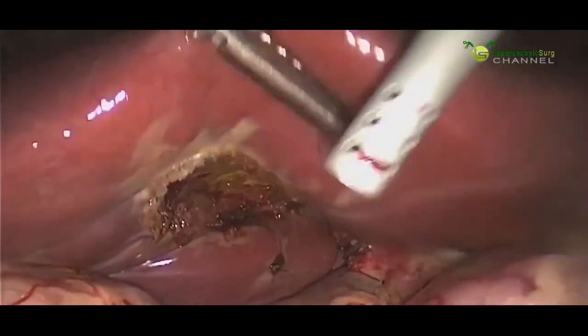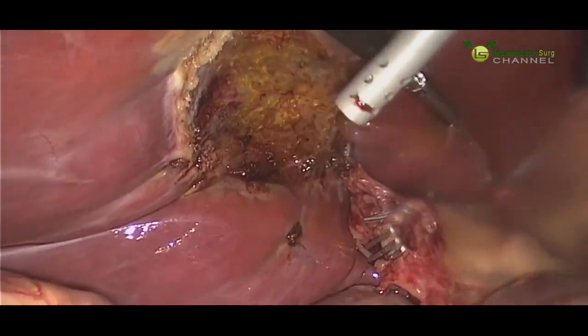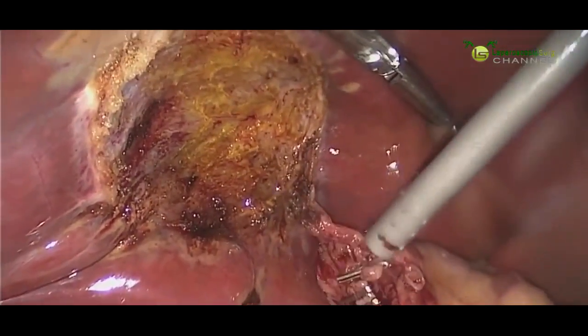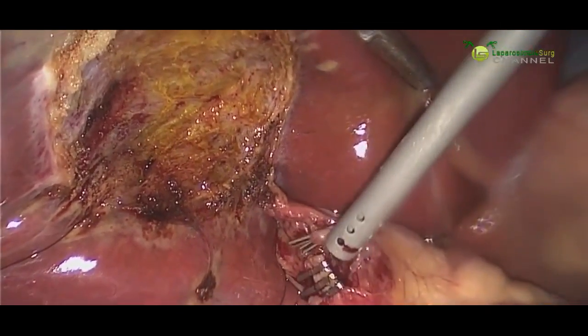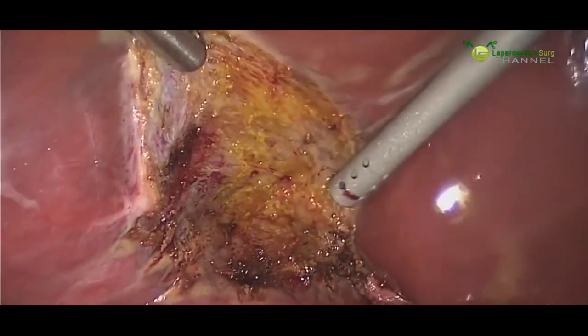And there we have it. Now that the gallbladder has been detached from the liver, we place it in this bag so that we can remove it from the body. But before we do, we'll take one more look under the liver just to make sure there's nothing bleeding and that our clips are in good position. We can see that our cystic duct is adequately clipped — there's nothing leaking from it. The cystic artery is also very well clipped with no bleeding, and there's no bleeding from the liver. So now we're ready to take out the gallbladder.